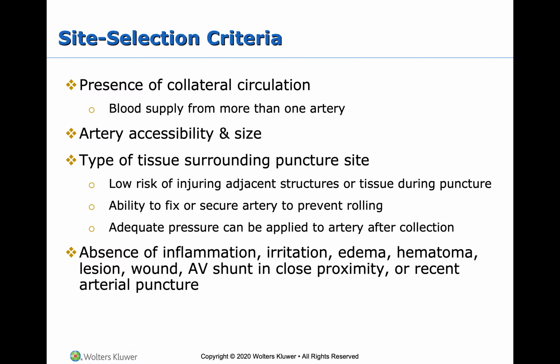And you want to make sure that you are able to apply adequate pressure to the artery after collection because, again, we'll learn more about this in chapter 6, but the blood flowing through the arteries has a lot more force behind it. So if you don't apply adequate pressure, there's a good risk of hematoma formation or significant bleeding, which you don't want. So you want to put adequate pressure for a while on that artery after collection to make sure that it stops bleeding before you wrap it up.